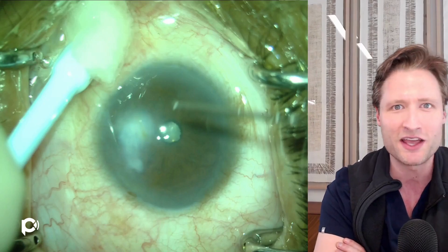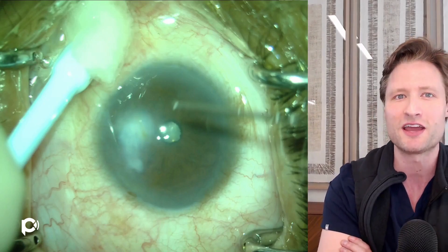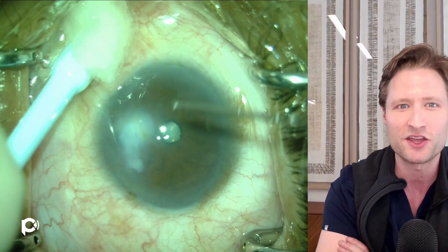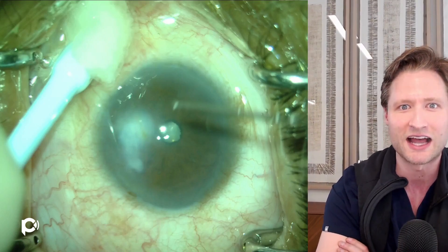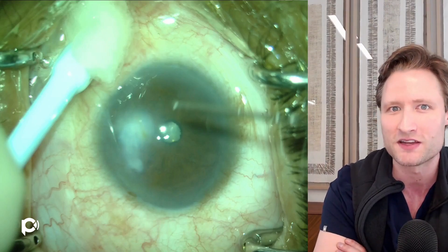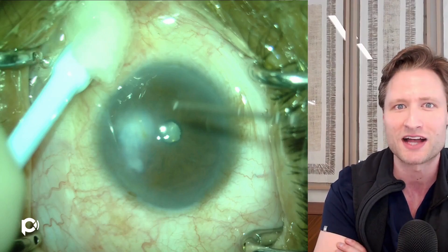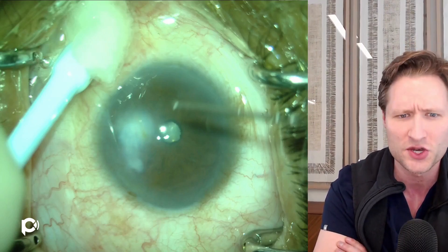In my experience, I found it useful to deliver a minimum amount of subtenons anesthesia — specifically, two cc's of lidocaine mixed with marcaine. That seems to be very effective at adequately anesthetizing the eye while at the same time not over-pressurizing the posterior globe.